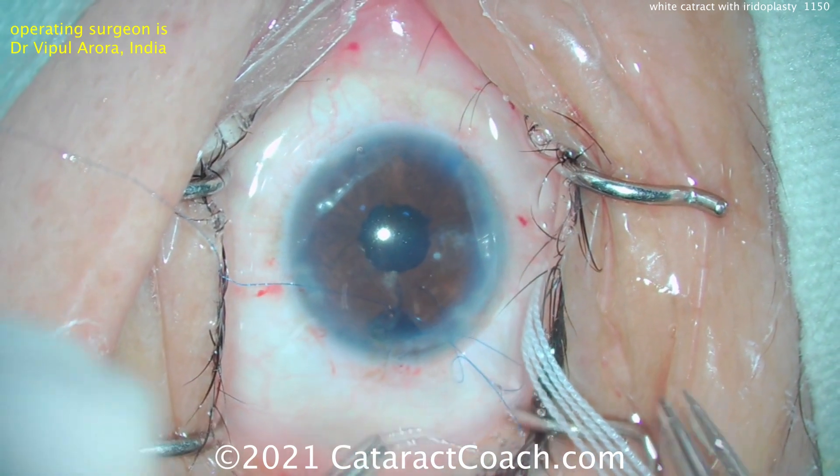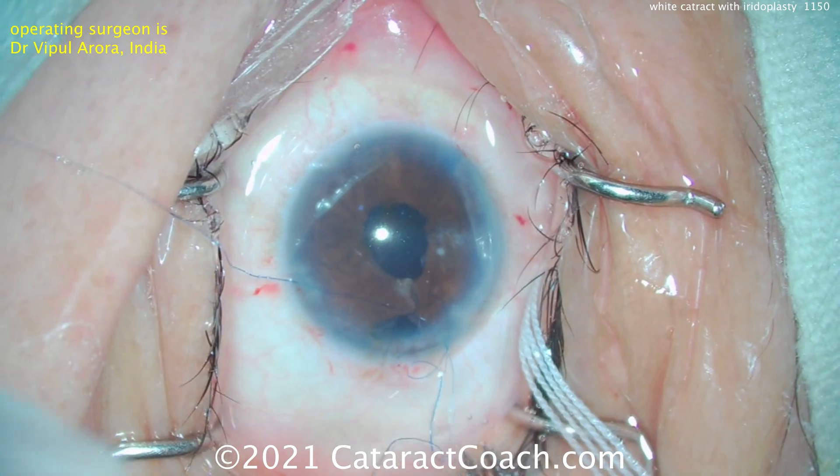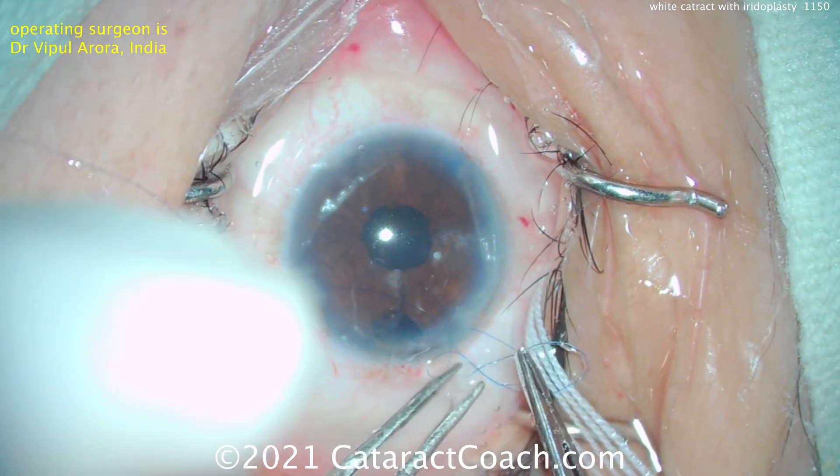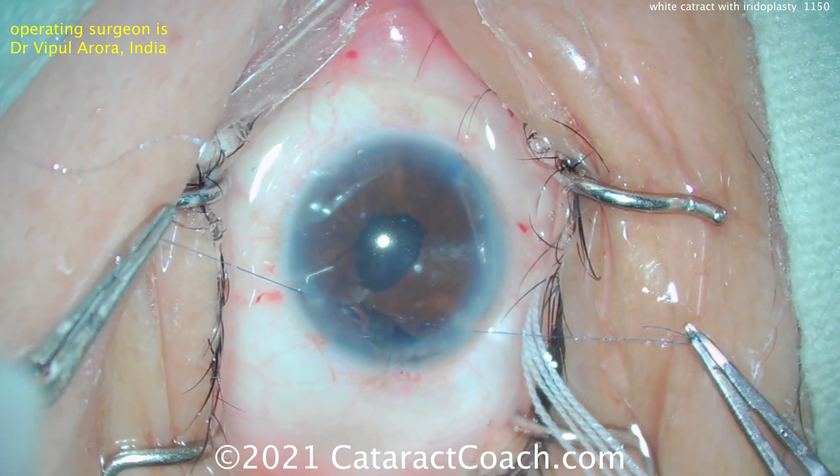So one, two, three, four throws — the four throws really helps in keeping that knot cinched down.